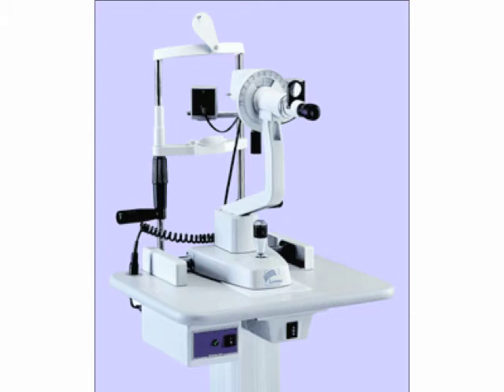And it sounds like it's a pain in the butt to use this sort of keratometer, and indeed it is. But it does not make the assumption that the place where the cornea is flattest is necessarily orthogonal to the place where the cornea is steepest.